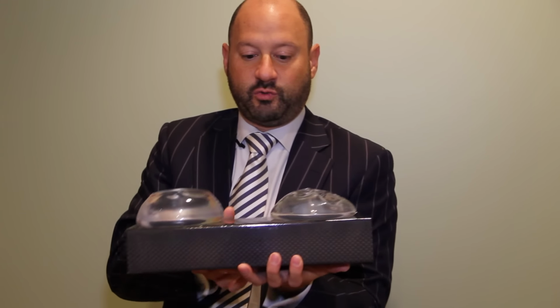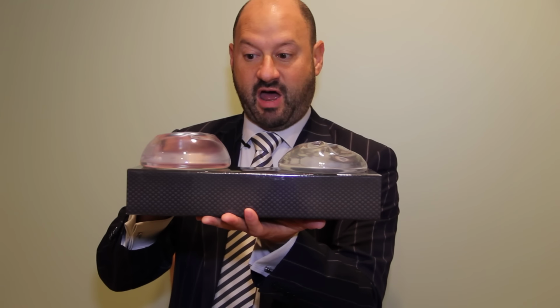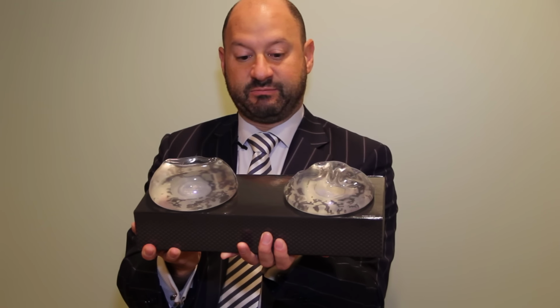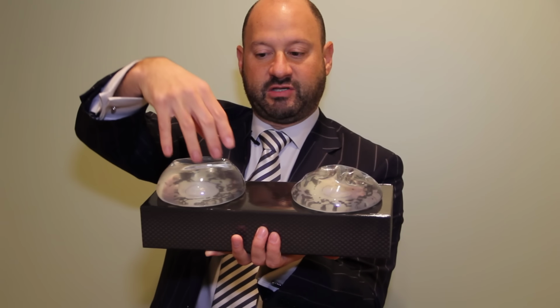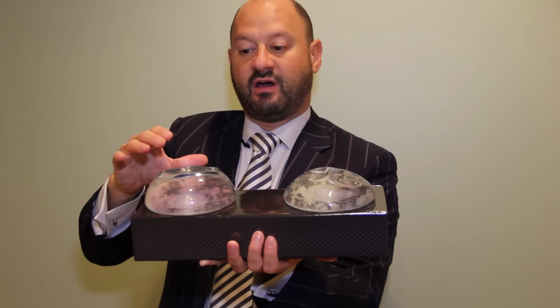So what really helps is to look at the actual implants to see what they look like. Here I have two implants. This one is a mid-range profile and this one's a high profile. What you can see with these two implants is that the width, or the diameter, of the implants is approximately the same. But this high profile implant sits higher this way. So for the same width of implant, it's actually about 100 cc's larger. So it would fill a larger bra size for the same width.